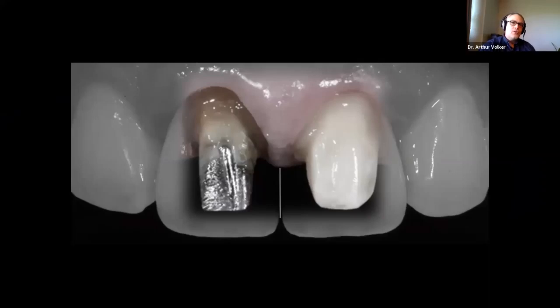The most translucent part about the tooth is always at the incisal third to the incisal fourth. So what really has to be masked is just really that mid-body. And then what the technician can do is they can add some effects, and this was done with an oral design laboratory. And beautiful work, beautiful aesthetic work, made a very, very nice aesthetic outcome for this.